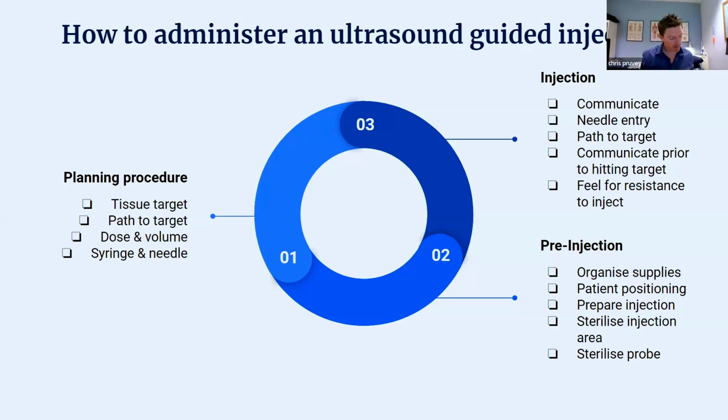And then it's just the type of syringe. So what are you injecting? You can have anything from a 1 mil syringe. And these are what we call Luer lock generally. So it just fits on just like this. Easy enough. So you draw up the medication, you change the needle. I'll show you that in a minute.